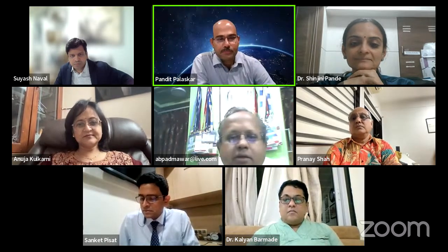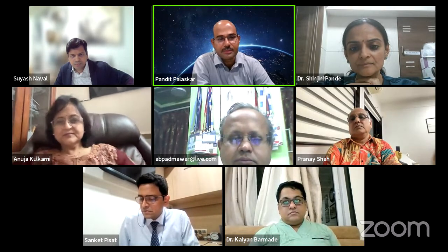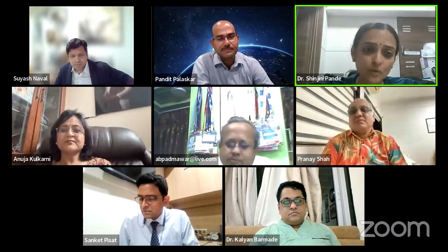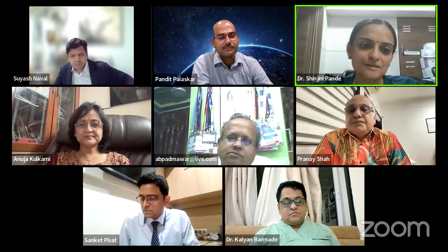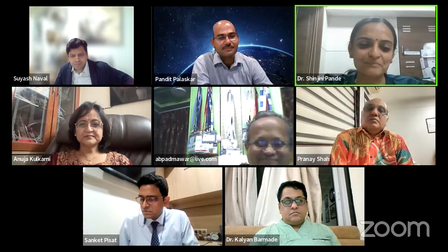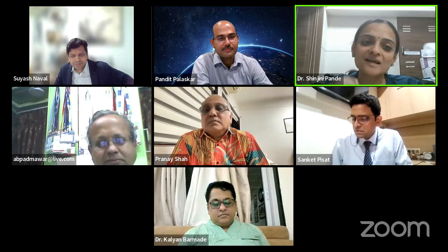One question to Shinjini. Yes, sir. During your presentation, you mentioned that the coagulating current is more injurious. So should we now only use the cutting current for coagulation? Yes, sir. Actually, the yellow pedal is the safest in terms of doing the entire surgery. Even if you notice, if you're doing a C-section and there is a rectus muscle bleed, by default we use the blue pedal, because we always see our seniors and mimic them. But you try using the yellow. Only thing, there has to be patience. It takes time to set the seal, but you will not have to buzz twice.